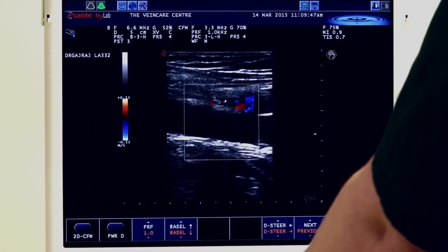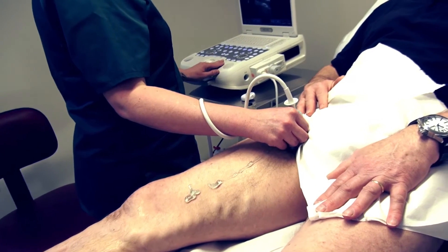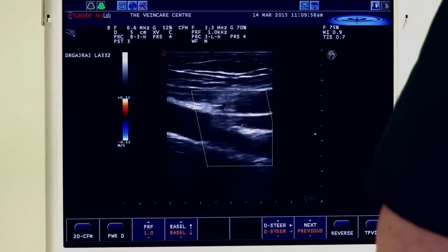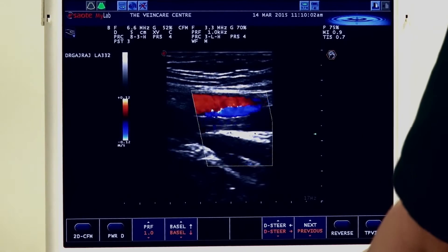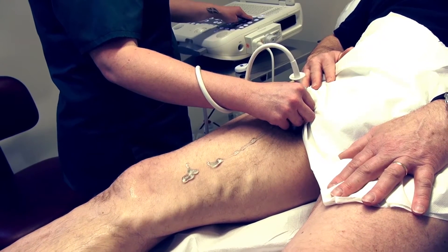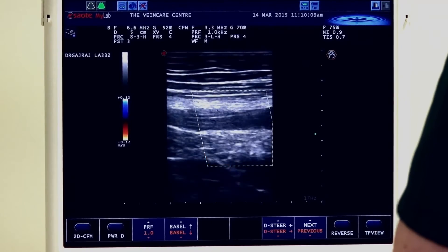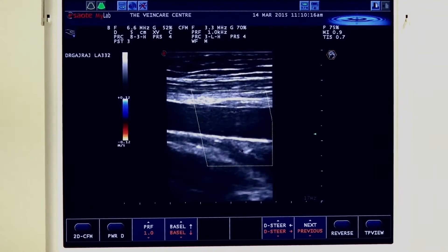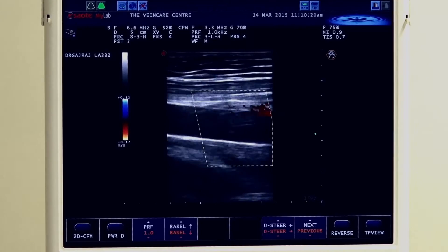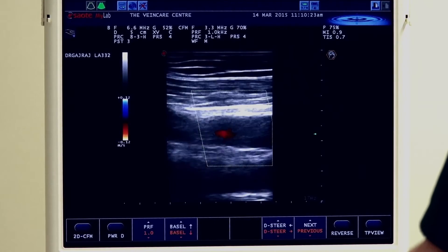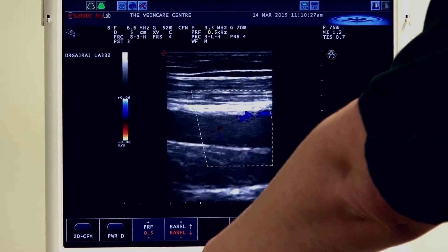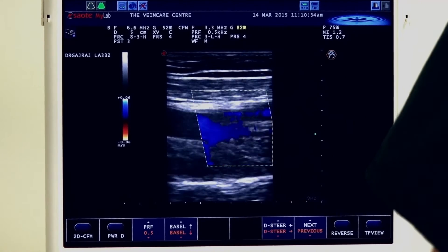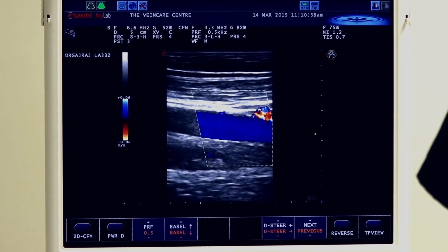We are going to follow the femoral vein coming down into the superficial femoral vein, angling our colour flow box to pick up that beautiful flow. Here we can see the divide into the profunda femoris vein and the femoral vein. You can reverse flow if you prefer to keep it in one colour — most machines provide that facility. Nice phasic flow is being represented. We can reduce our pulse repetition frequency or scale to help demonstrate full vessel flow, and increasing the overall colour gain gives us a much nicer image of that femoral vein.